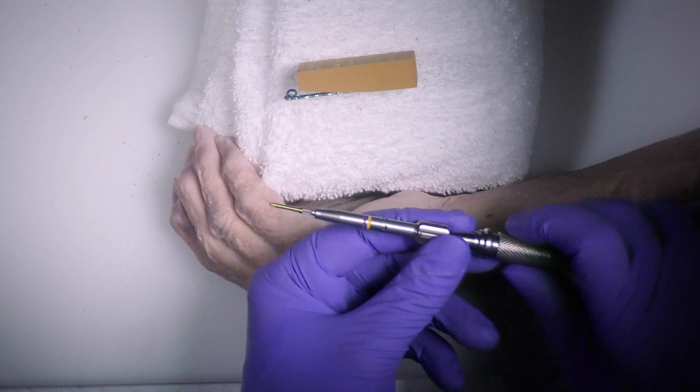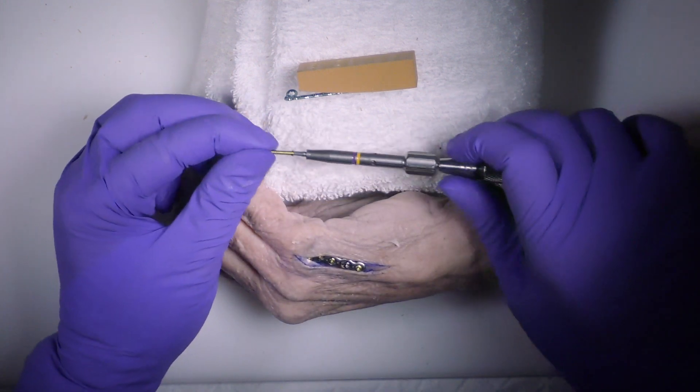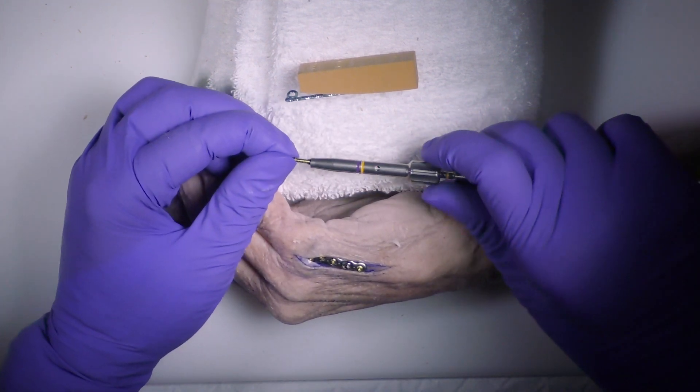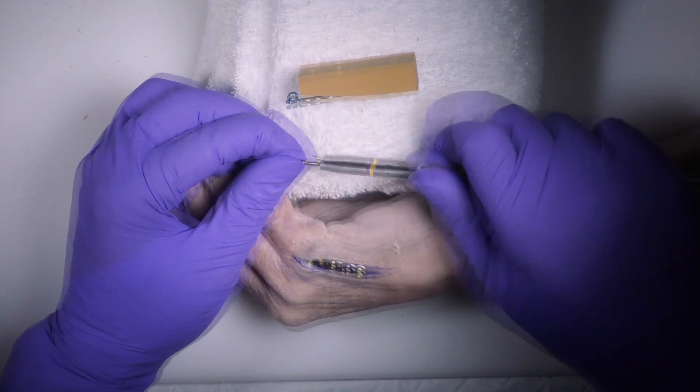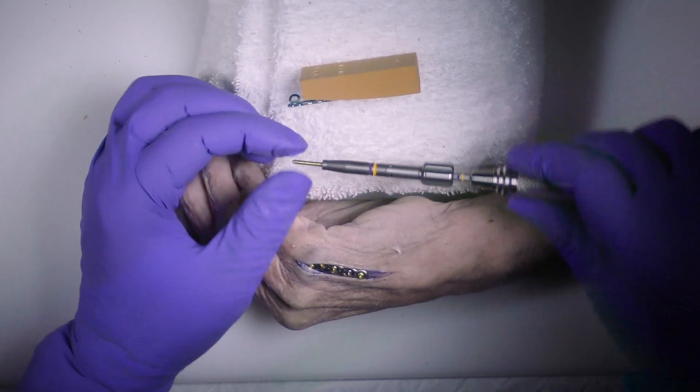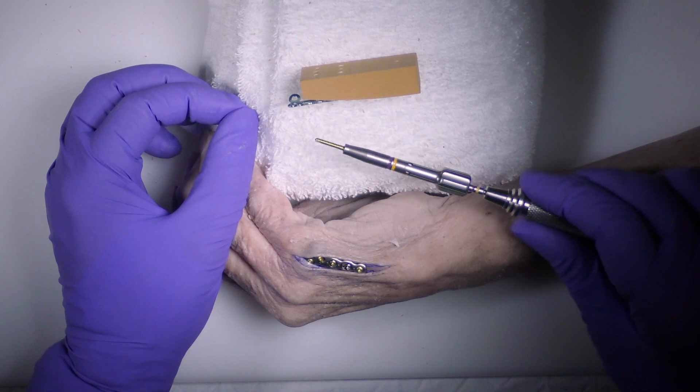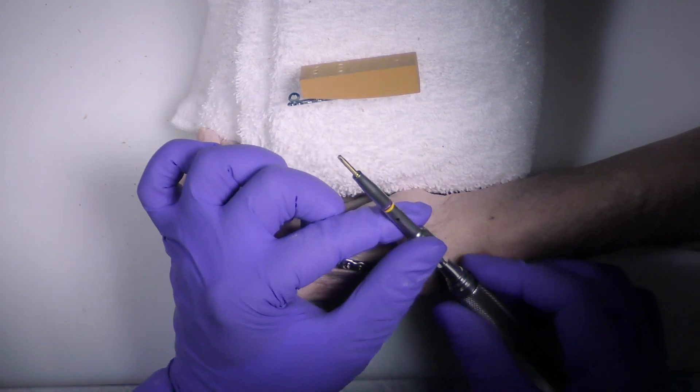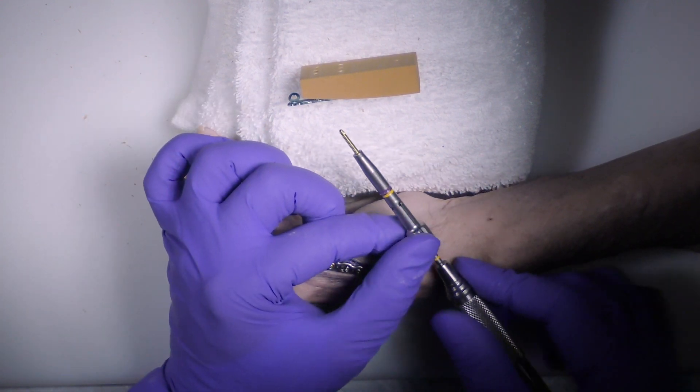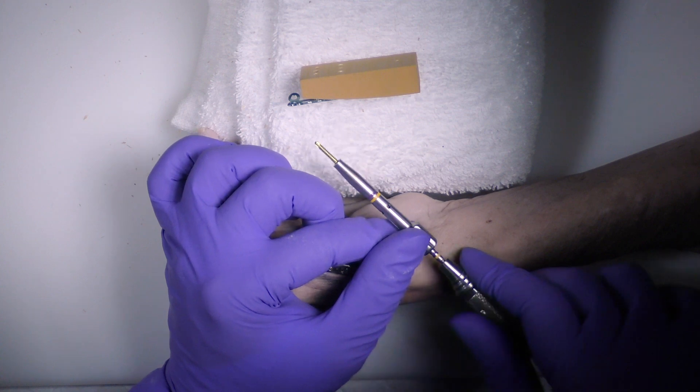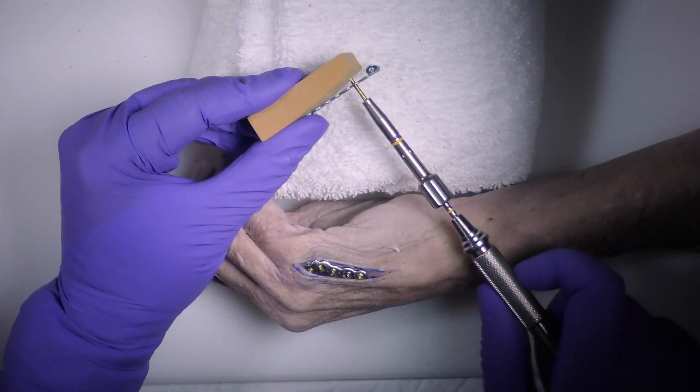Alternative to this is this device, which is a sleeve that goes over the top of the locking screw called a save lock. It captures the threads of the screw head, so it basically makes it like a non-locking screw. The threads are no longer evident on the head. We'll apply this here.